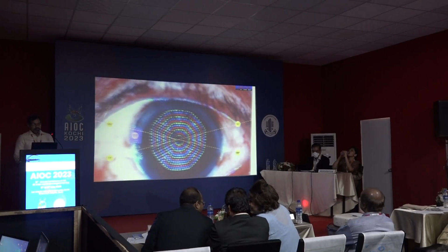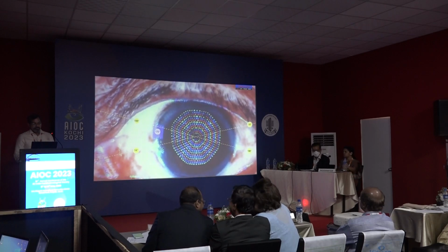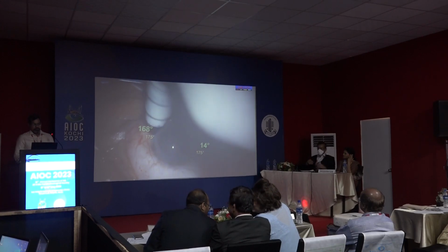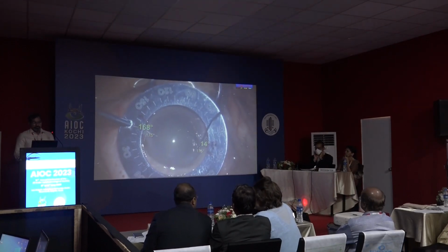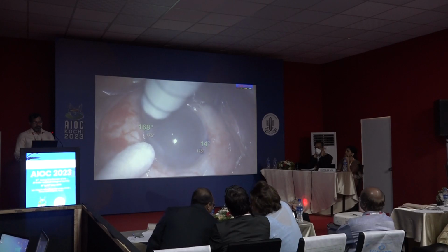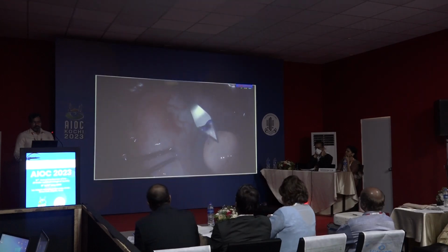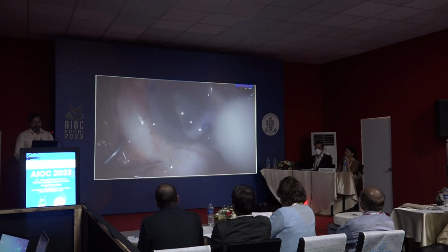by using incision. Identify and mark two prominent limbal structures which are at 14 and 168 degree in this case. Intraoperatively mark the same points on the limbus using marker. Using these landmark points as reference, I mark the site of incision at 175 degrees on both sides. After lens implantation, a 2.8 mm OCCI was done and the main incision was extended to 5.5 mm.